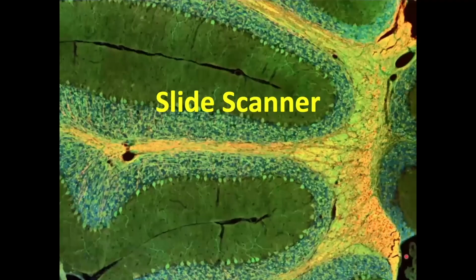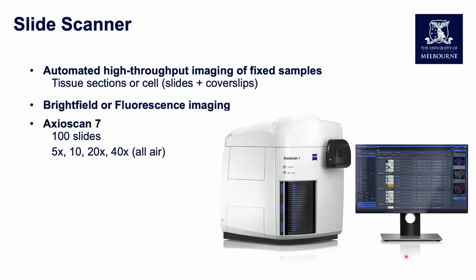The next approach that we're going to look at is the slide scanner. This, again, is very much a fixed sample approach. In this case, we would be taking either the paraffin or cryopreservation approach of fixing, embedding, and sectioning onto slides. The power of this system is that it is high throughput. This is our slide scanner, the AxioScan 7. We can load in 100 slides at a time, and we can get it to semi-automatically find the tissue and image whatever channels we want.